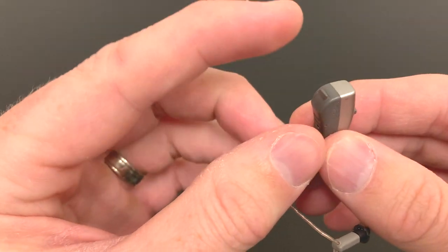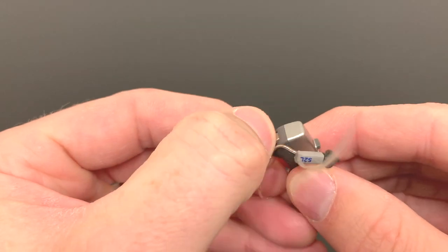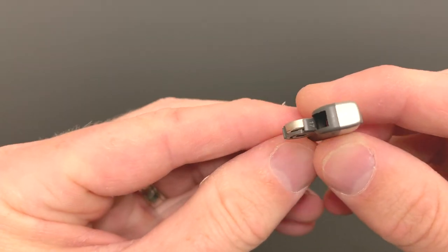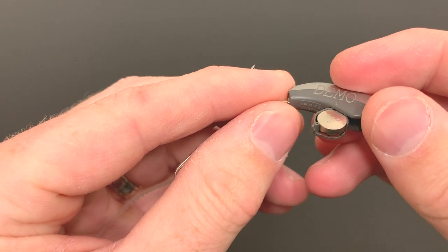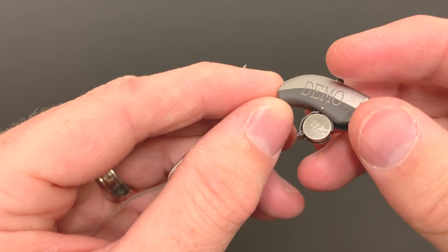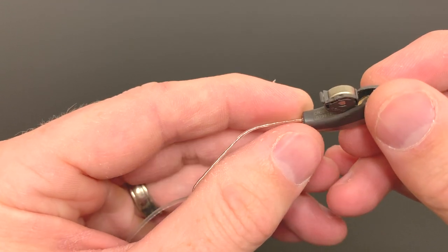On the bottom of the hearing aid is the battery door. Most have a little notch here that you can grab and pull open and you'll see your battery right there. The battery in most of these hearing aids only goes in one direction. You always want to make sure the hearing aid battery is placed in the hearing aid correctly. So that is where your hearing aid battery goes.